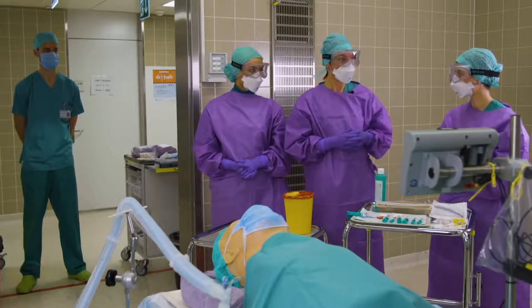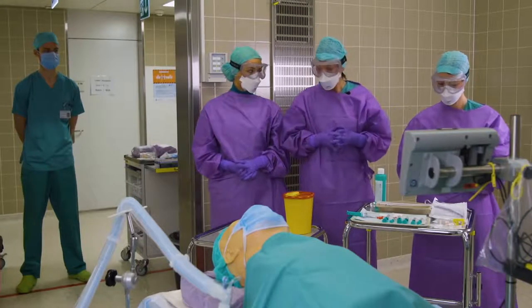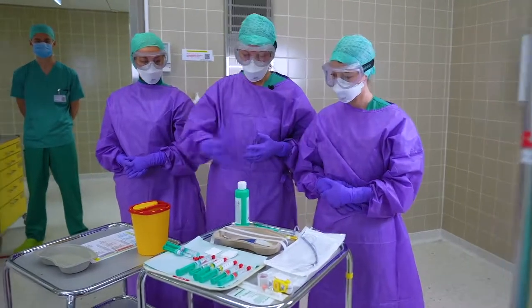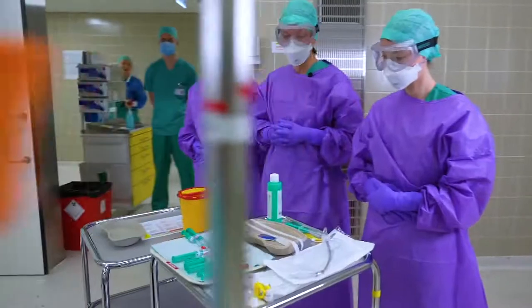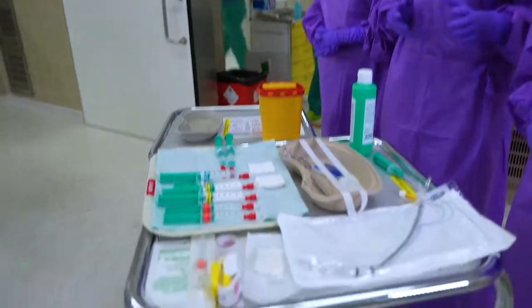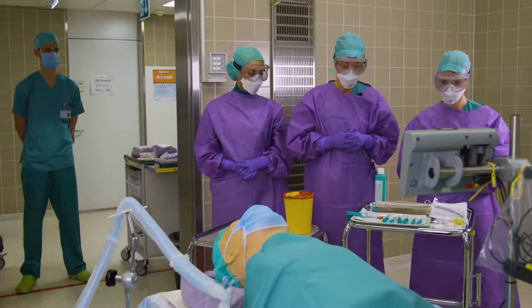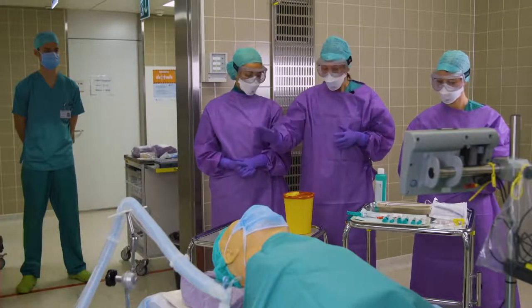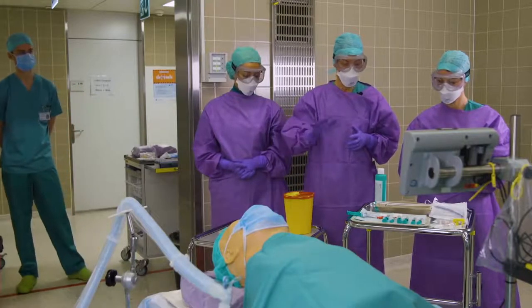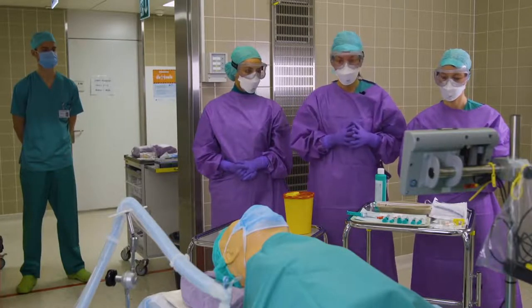We did our body check and we deemed each other appropriate for this procedure. For induction, we have our medications on the tray, as well as our airway materials, including an endotracheal tube with a stylet in place, as well as our video laryngoscope. Next to the induction table, we have our dirty tray for dirty materials to be disposed there. It's also important to have a trash bin next to the patient so you can drop dirty articles right into the trash bin.